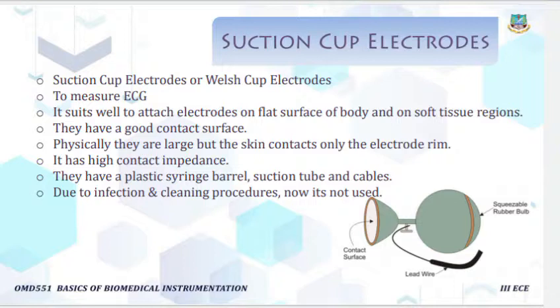Due to the various cleaning procedures, there are many infections from this. So due to the infection and cleaning procedures, it is not used now. This comes under the suction cup electrode.